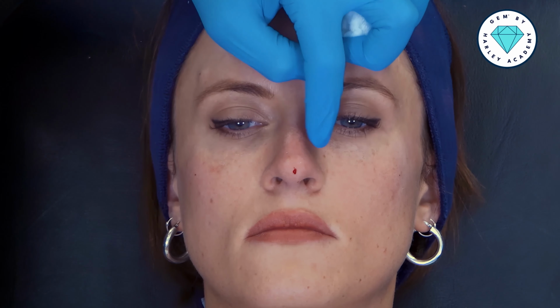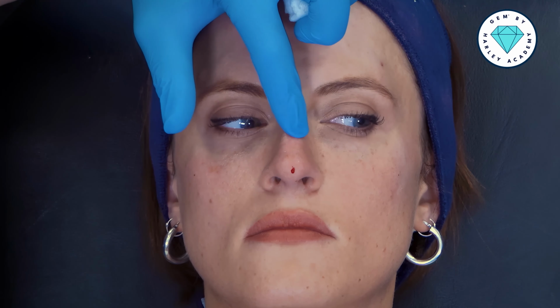That's now addressed the gap that Claire was worried about on this side of the nose. Oh, wow.